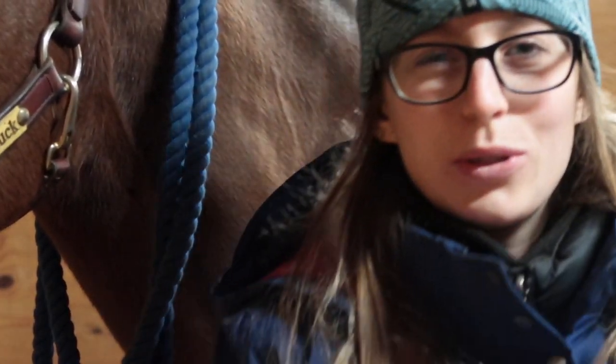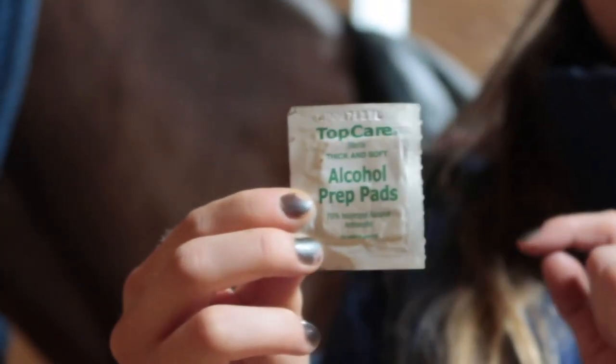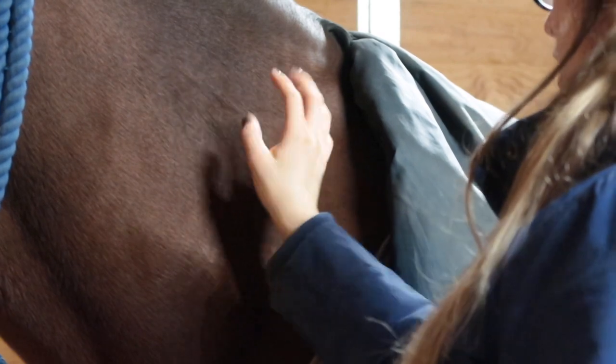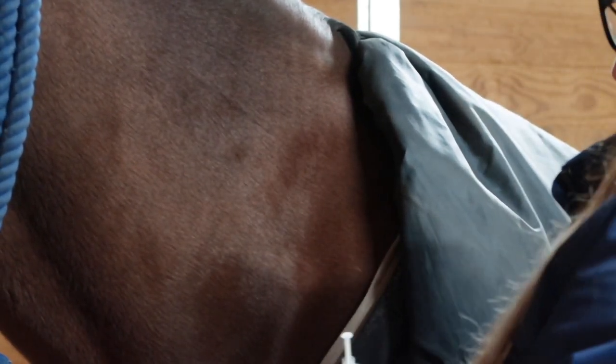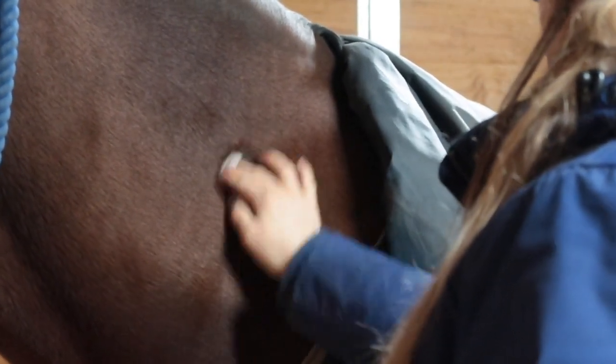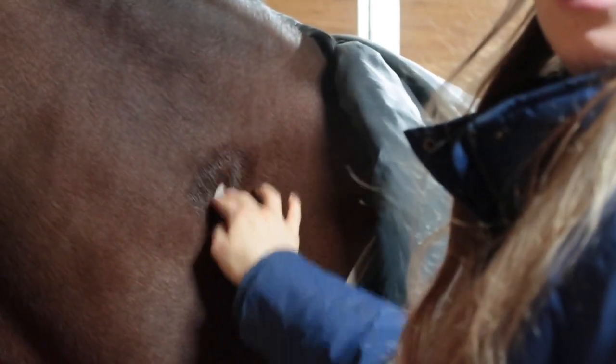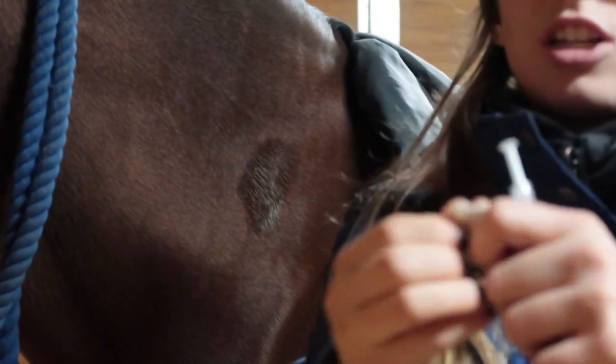I'm not sure if you need to do this but it did say to do it in the directions. I like to draw on my triangle and make sure I'm in the right area. Then take your alcohol wipe and clean the area just like this. I also like to just do the tips of my fingers, just because you're going to be touching the area that you just cleaned.